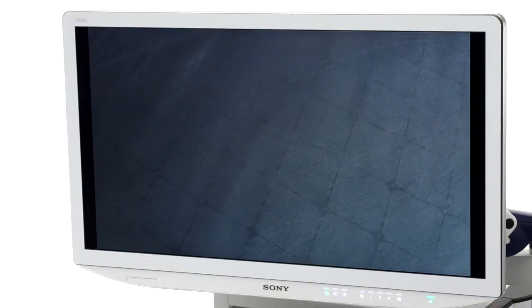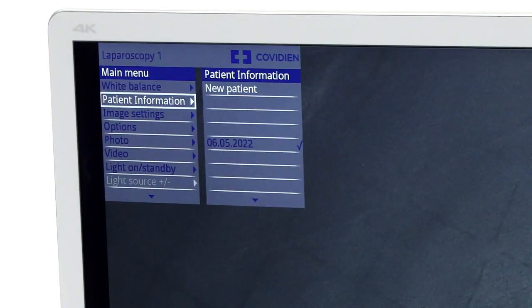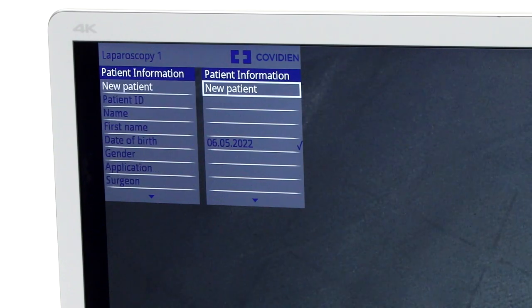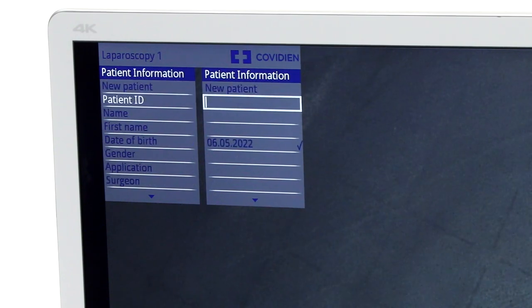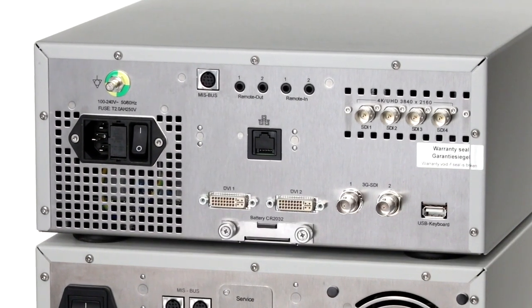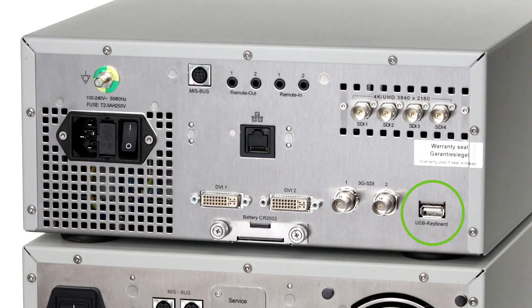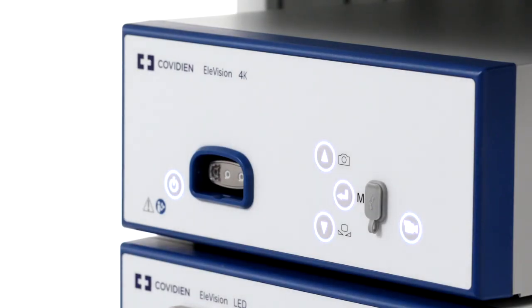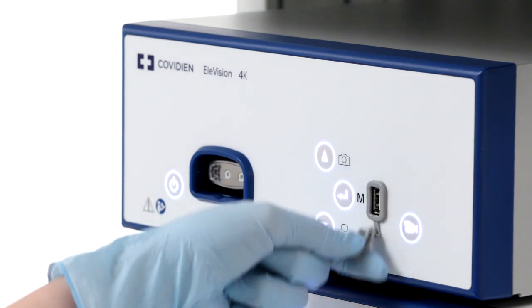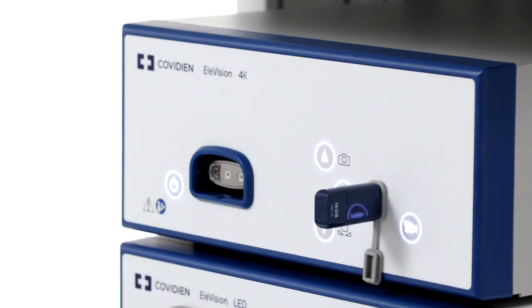To enter patient data, you'll need to create a new patient profile in the platform. This should be done at the start of every procedure. This ensures that the photo captures and video recordings taken during the procedure are saved in a separate file folder specific to that patient. A keyboard can be connected to the CCU in order to enter patient data. Connect a USB storage device in FAT32 format to the front of the CCU, ensuring the USB has enough disk space to save any photos and recordings made during your session.